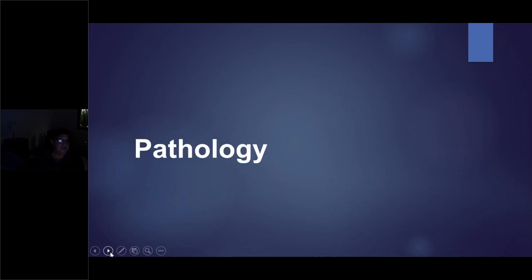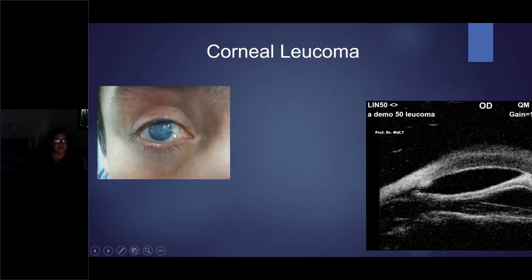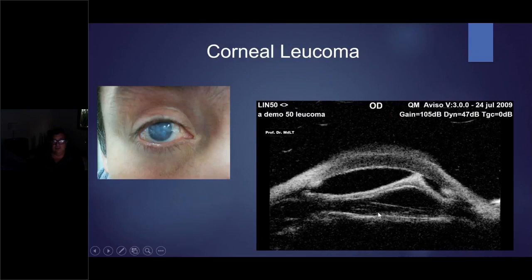Let's see some pathology in the cornea. Sometimes patients come to us and we can see there is no lens here, there are synechiae, edema, leucoma, vitreous coming inside, angle closures, a lot of things that you can't see with another method, even with OCT. Detachment of Descemet's membrane.